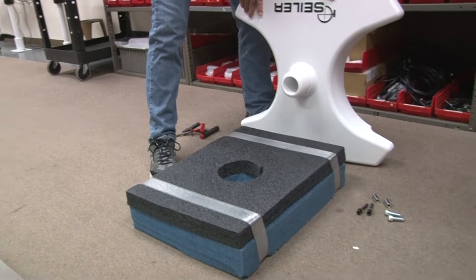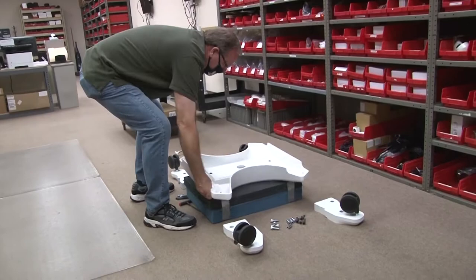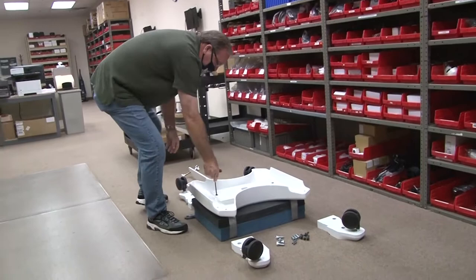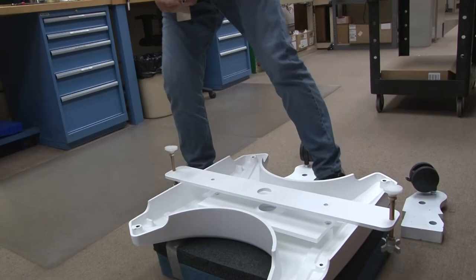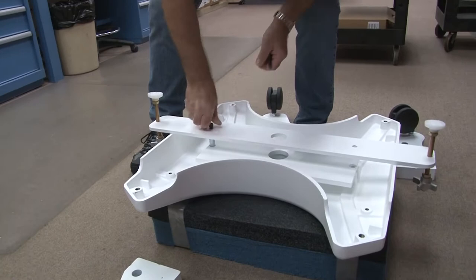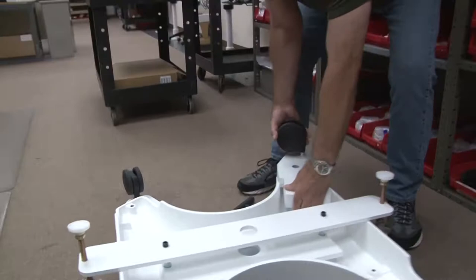First, take the base and set it on something where the neck is going to fit through. Use blocks on the ends about five inches high. Remove the two screws, then add the white pads facing up, place the spacers between, and add the weights.